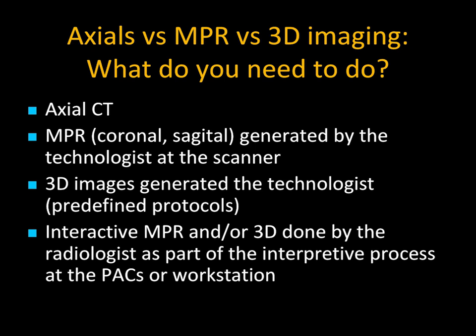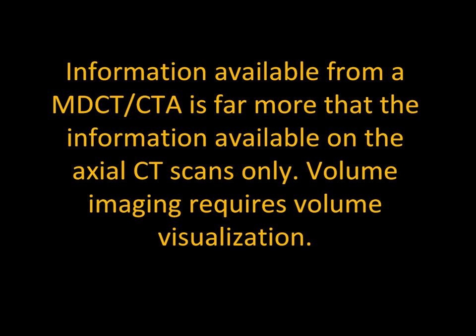Okay, going back to protocols specifically. We mentioned before that you need to do more than axial imaging. MPR we routinely generate, many of you do, at the console with the technologist, so it saves time for the radiologist, so it gets done. 3D imaging is very valuable. It's still a small percent of people who use 3D. Forget arguing MIP versus VRT versus cinematic. People do nothing. I think interactive rendering is critical. The workstations have never been designed to do this well, so that's still a problem. Hopefully in the future, it will get done better.